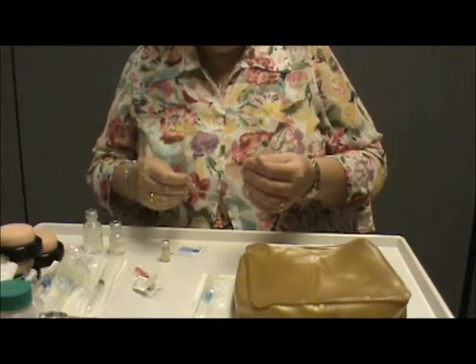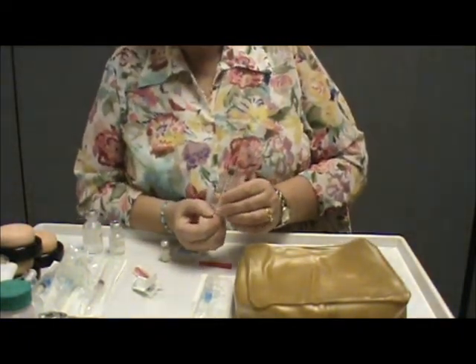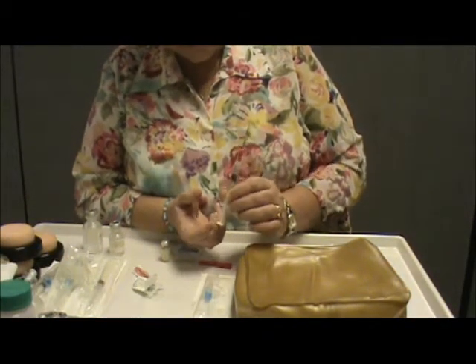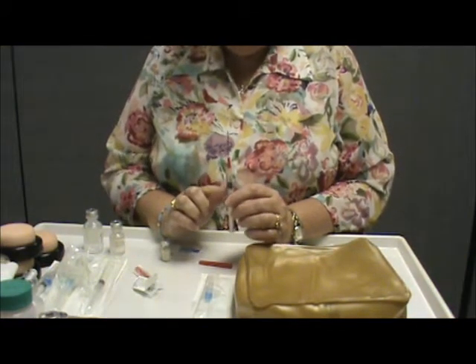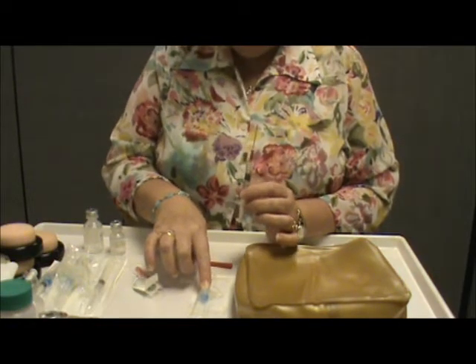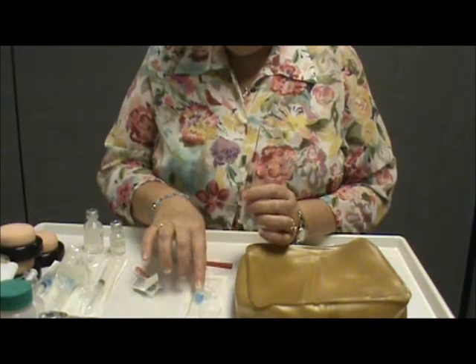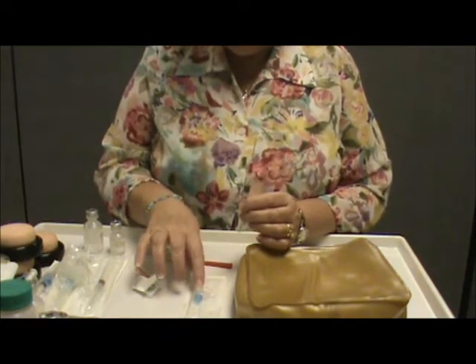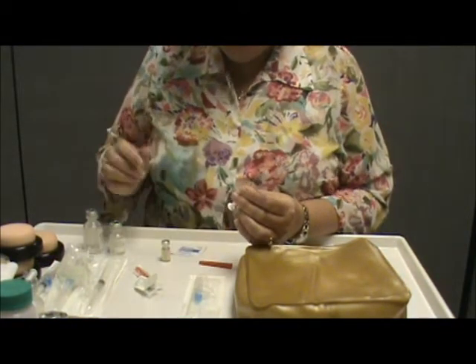Let's say that I'm going to draw up 1 milliliter of medication, and what I want to do when I need a milliliter, I need to add an extra tenth to it, because ultimately I'm going to be changing to a needle with a dry hub. And if I don't draw an extra tenth, I'm going to be a tenth short when I inject into my patient. So I want to pull it back an extra tenth.